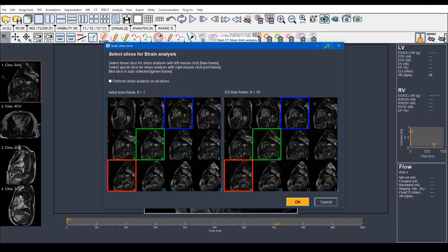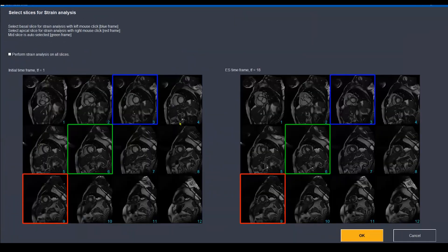It will open the same window, but now with the correct end systolic phase. Of course, you have already noticed that the nice slice we selected before is not that nice during systole — it lost some parts of the myocardium. So this will give us very wrong results if we selected this slice. For me, I will go further downward to select a different slice instead.